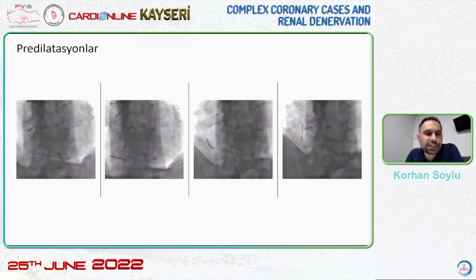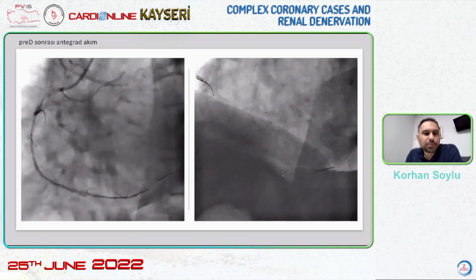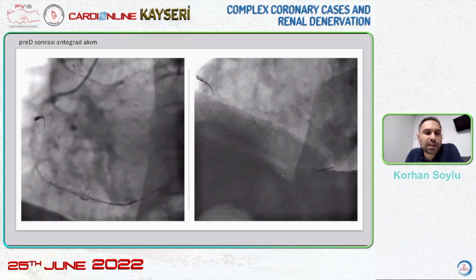And we changed our distal wire with another one, a floppy one. And after pre-dilatations, we ensured antegrade flow.